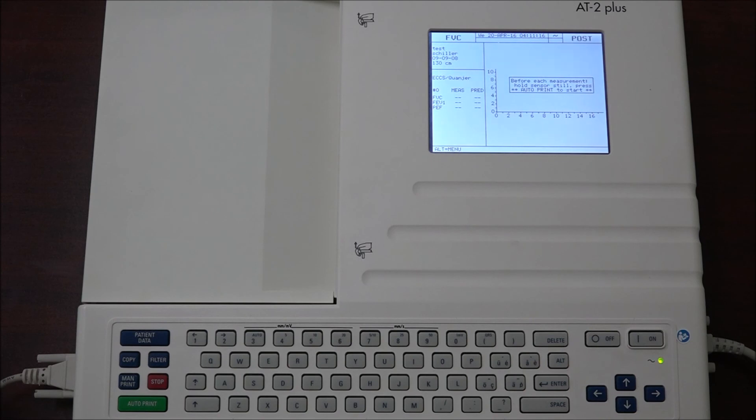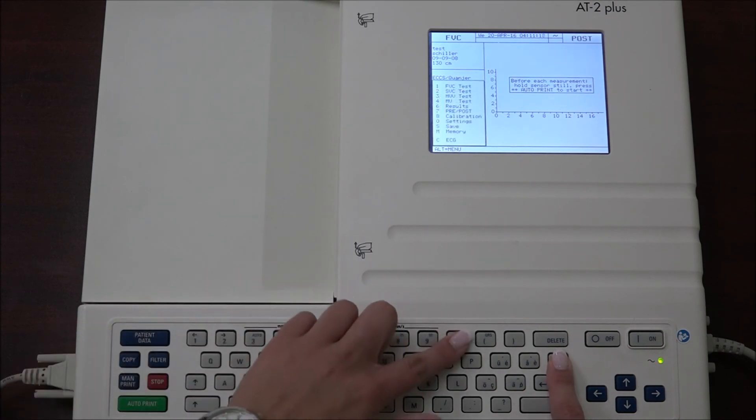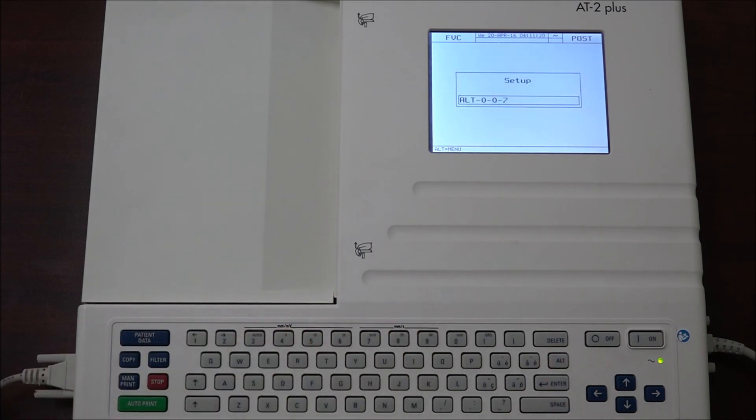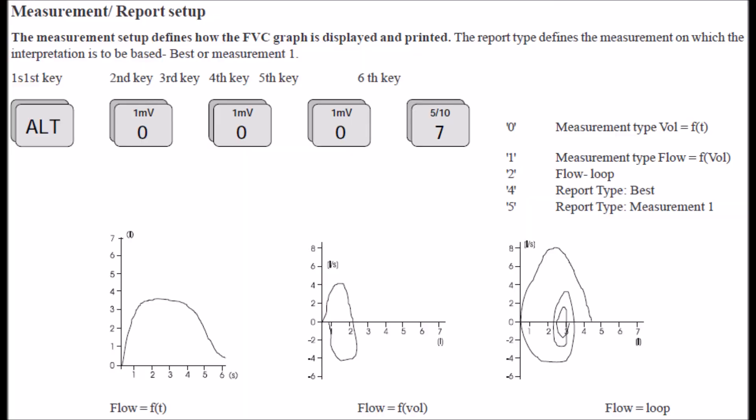To begin the measurement setup, begin by pressing ALT 0 0 0 7.